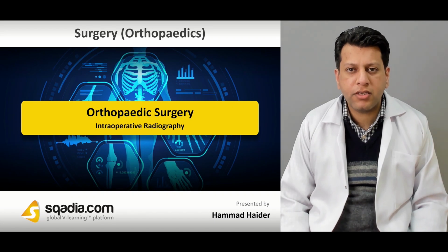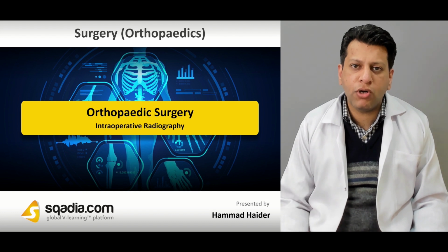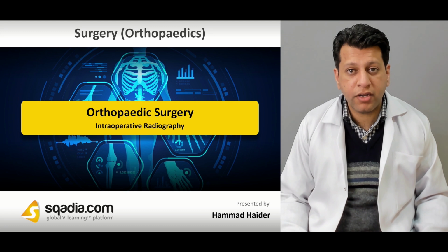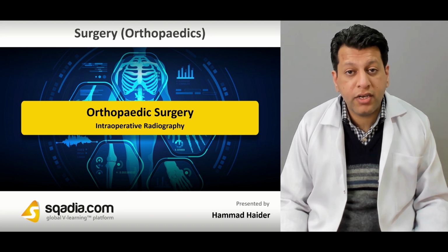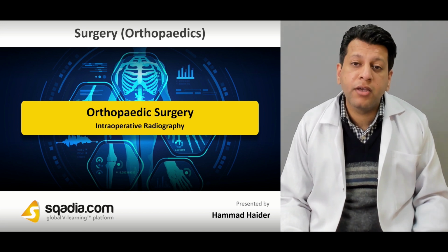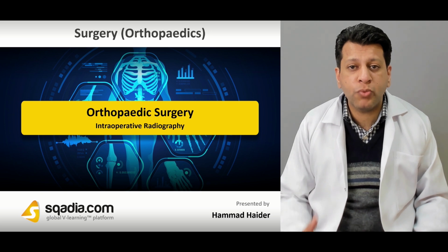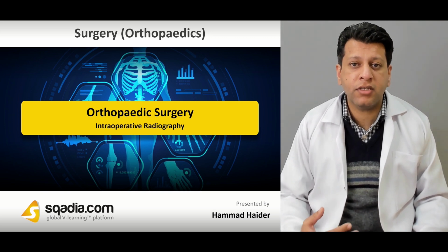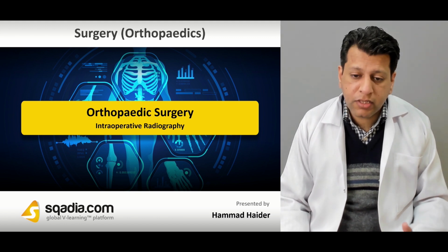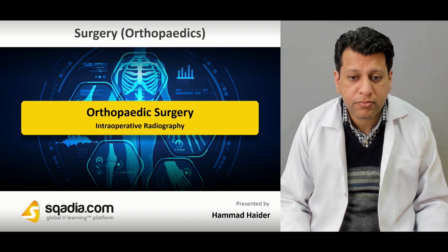Now, in the previous section, we discussed pre-operative planning. Yes, we need to do all the x-rays and workup beforehand, but sometimes we need intraoperative radiographs as well. Why do we need them? To get a better, 3D sense of what we are doing. Plus, sometimes a situation arises, like a perioperative fracture, for which we have to change our planning accordingly. Therefore, we need intraoperative radiography.